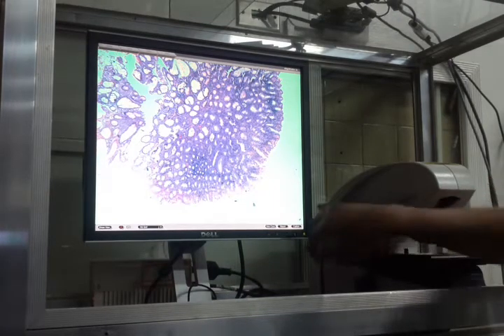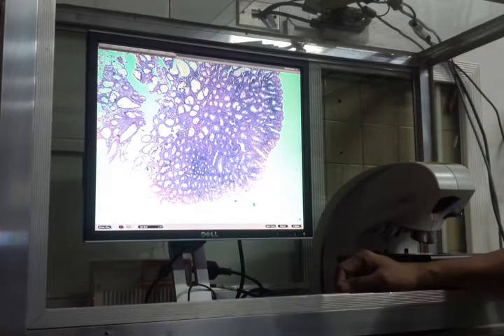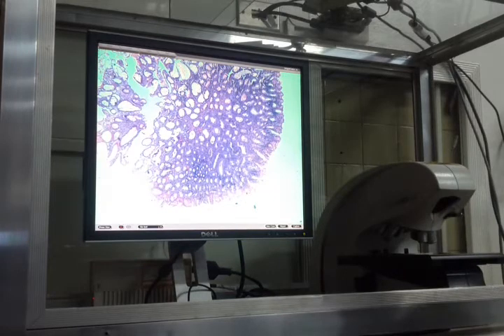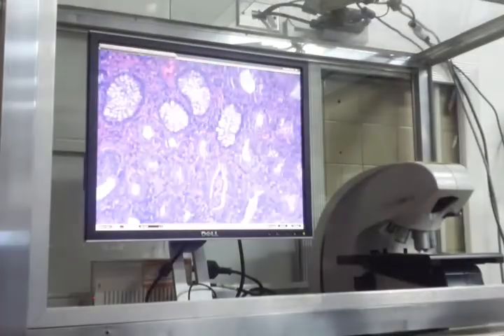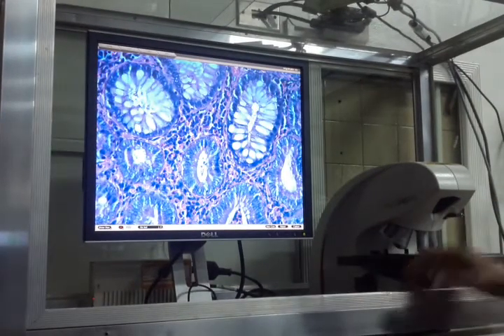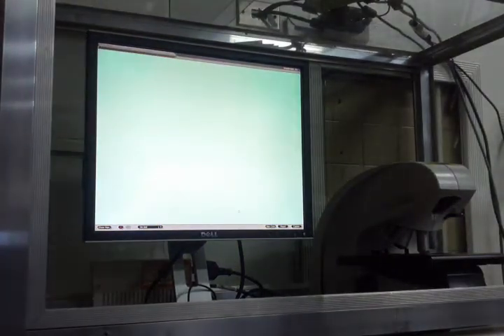Pag ganito yung pinakita sa inyo na tissue, dapat alam nyo, hindi naman necrotic eh. Ano ba yung nakita nyo mga intestine, yung mga pinakita ko sa inyo? Yung isa yung may hemorrhagic necrosis na may hemorrhagic infarct. Okay? Blockage ng SMA. Red infarct. Eh ito, wala naman siyang hemorrhagic necrosis, di ba? Nakikita niyo yung lining. Nakikita mo these dysplastic changes. O tubular adenoma, pre-malignant condition. But it's now considered as benign. Pero, alam mo na pwede siyang maging malignant. Meron kang dysplasia. Adenocarcinoma.